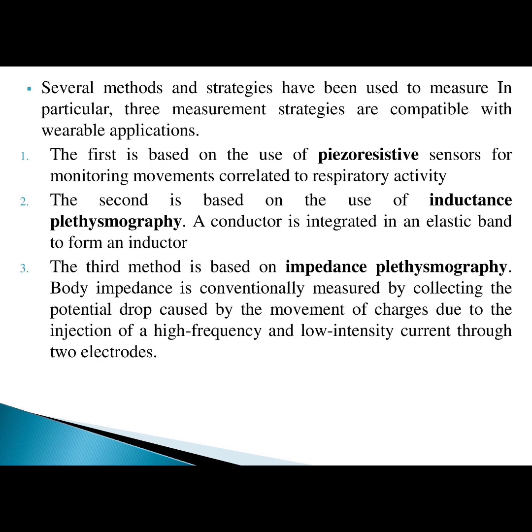The second is based on the use of inductance plethysmography. A conductor is integrated in an elastic band to form an inductor. The third method is based on impedance plethysmography. Body impedance is conventionally measured by collecting the potential drop caused by the movement of charge due to the injection of a high frequency and low intensity current through two electrodes.